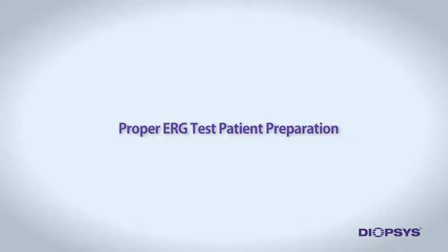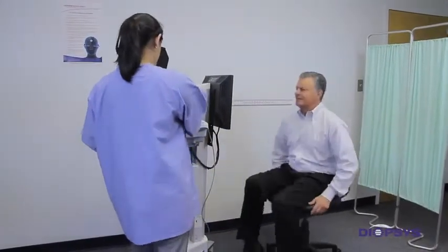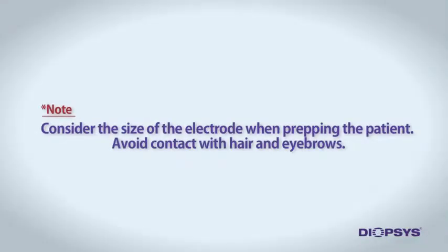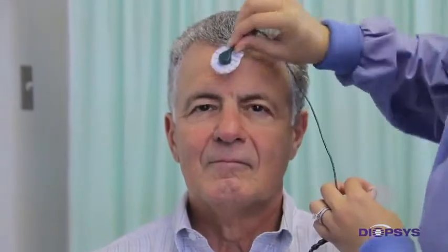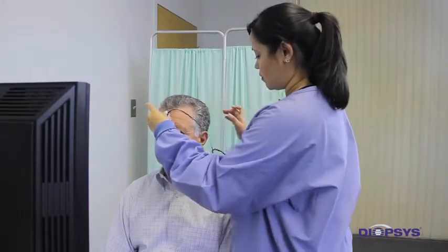Properly prepping the patient for the ERG test is one of three important steps in the testing procedure, since proper electrode application is crucial in achieving quality test results. Once the patient is comfortably seated, using a clean gauze pad, apply a pearl-sized amount of NuPrep gel onto the skin on the center of the patient's forehead with moderate pressure. Be sure to consider the size of the electrode when prepping the patient — the electrode should not come into contact with the hair on the forehead. Gently remove all remaining gel thoroughly with a dry part of the gauze. Place a pearl-sized amount of 1020 conductive paste onto the cleansed area and the center of the forehead. Snap the green lead wire to a disposable EEG electrode, then place the center of the electrode directly over the conductive paste on the forehead. Adjust the lead wire so it rests behind the patient's ear.